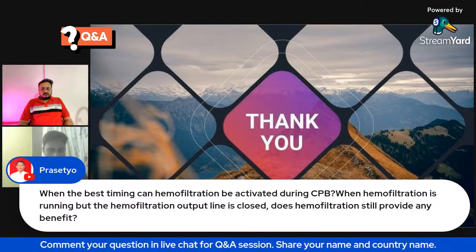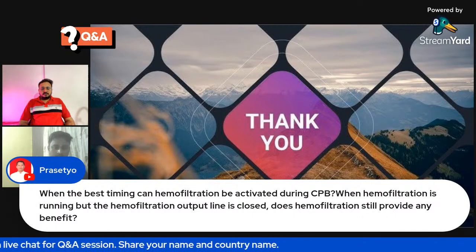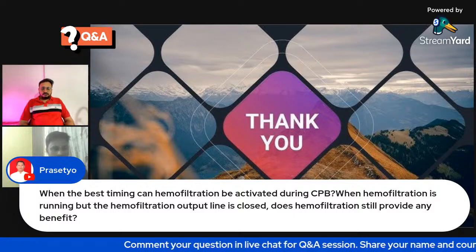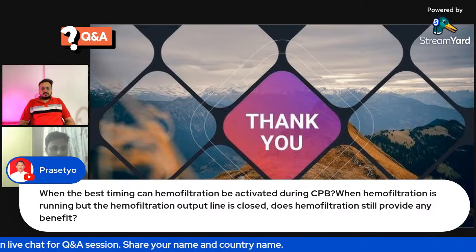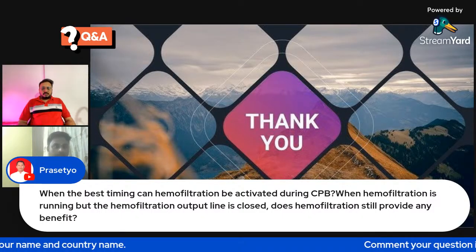Sir, if the suction line is open, meaning the hemofiltration outlet line is closed, then according to transmembrane pressure, the blood flow through the hemofilter will reduce. So no benefit, sir. Actually, it will reduce the hemofiltration rate. Hemofiltration majorly depends upon the blood flow.